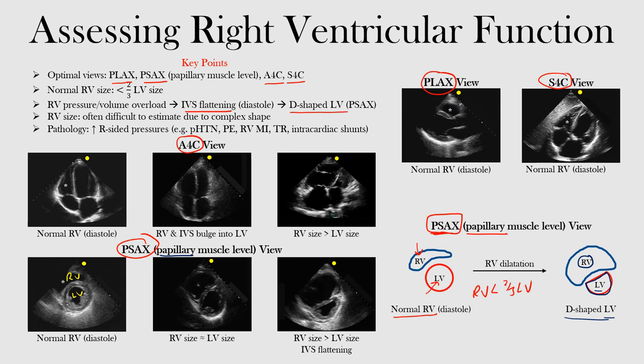If you're not aware of any of these views or the windows used to obtain them, go back and listen to the earlier lectures that explain how to obtain the different levels within each window. Here we have the right ventricle and the left ventricle — that's normal diastole, normal size. Notice that the right ventricle is smaller than the left ventricle. Now in the second image, the right ventricle is bigger, almost the same size as the left ventricle.